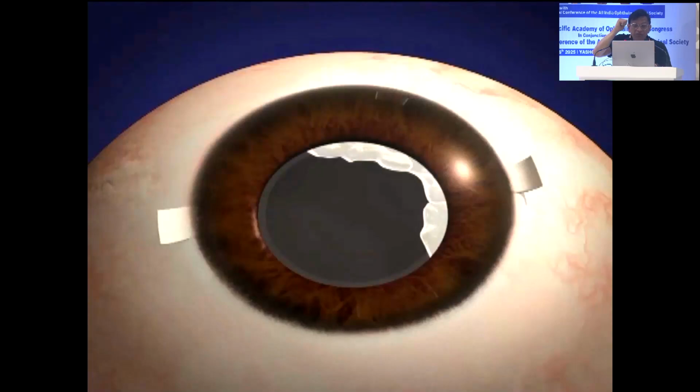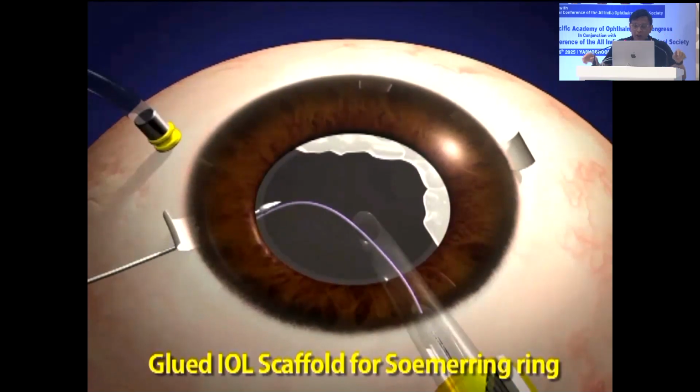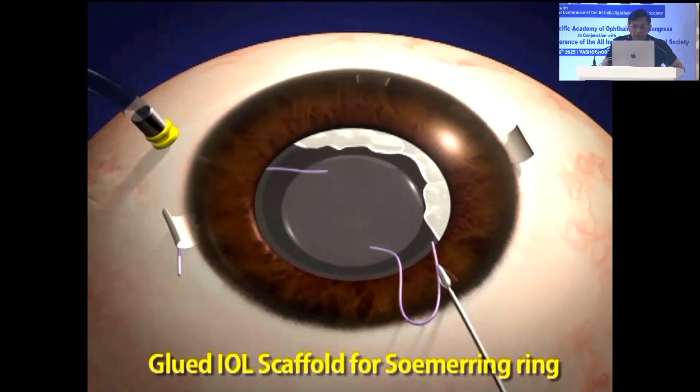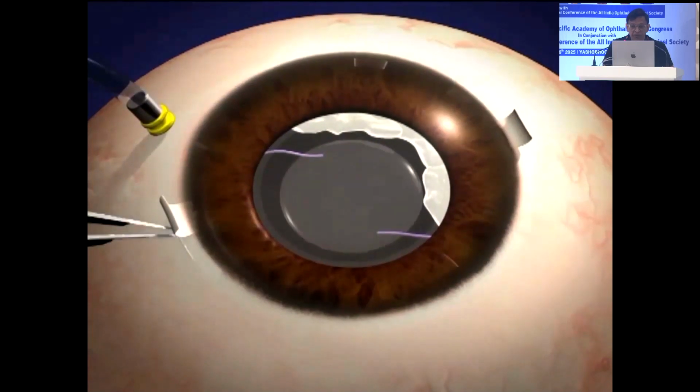Remember, I have to put in a scaffold, which means I have to create a capsule of my own. But where will I put the scaffold? I have to go behind the Soemmering ring. I cannot go in front of the Soemmering ring, obviously. If I go behind the Soemmering ring, there's no capsule, there's no iris. So the only way you can do it is to do a glued IOL and use the glued IOL as a scaffold. So see this animation, I'm making the glued IOL. Now this glued IOL works like a scaffold.